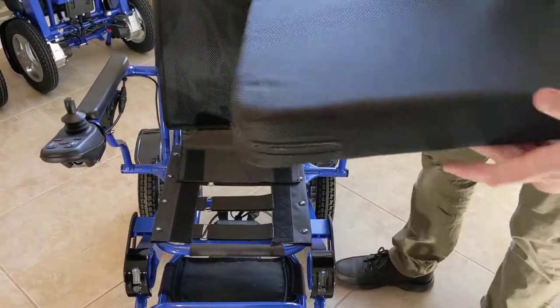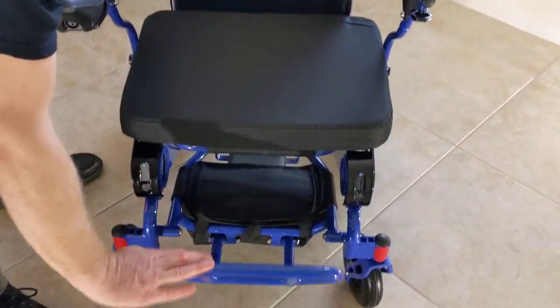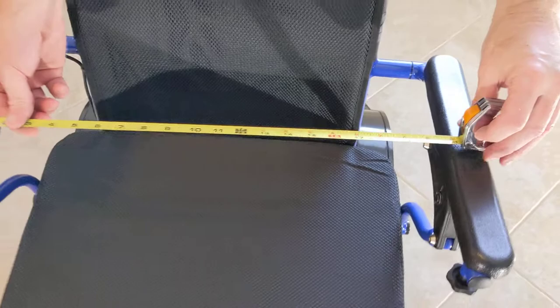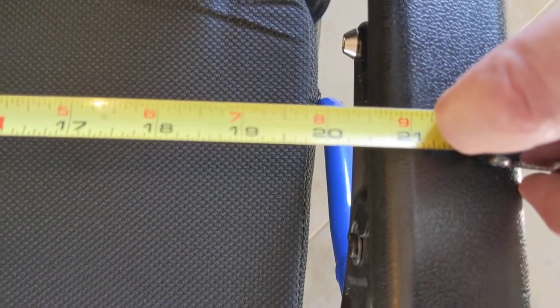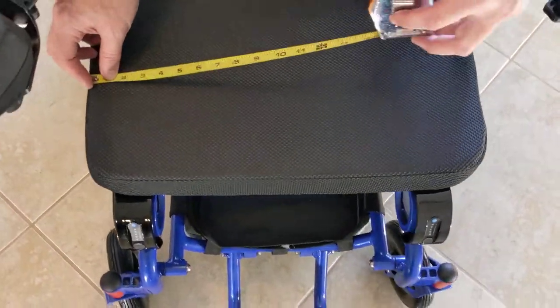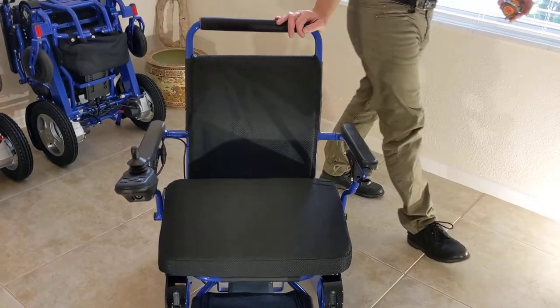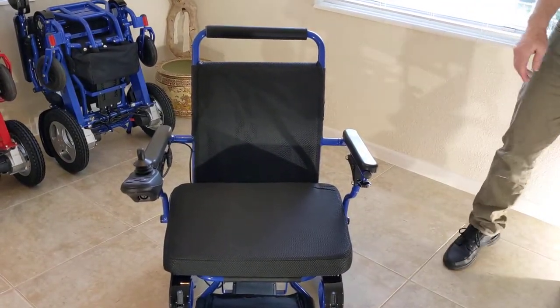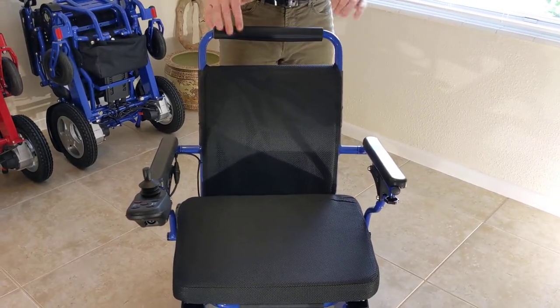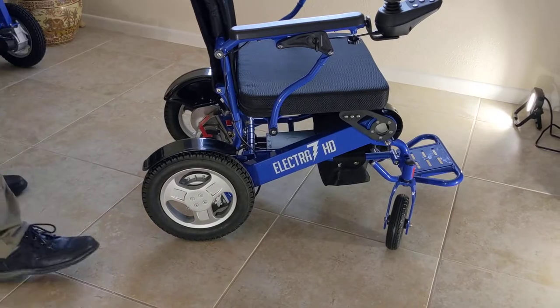We have the back piece that folds over nice and snug, and the actual cushion that you would sit on. A couple of important measurements: the space in between the armrests is 21 inches from the factory, and the seat cushion itself is 20 inches wide on the most recent model. There are separate videos covering all measurements of this chair.